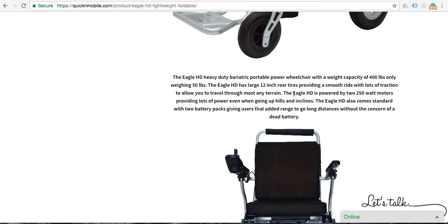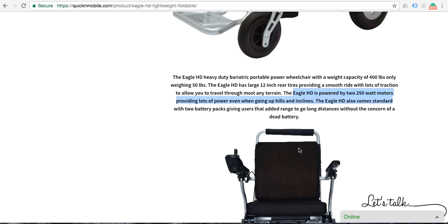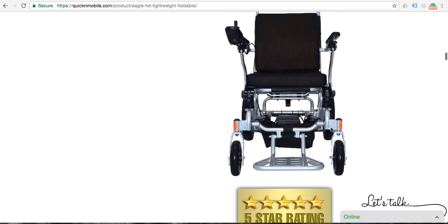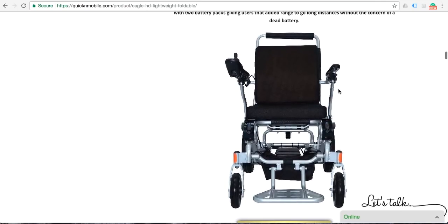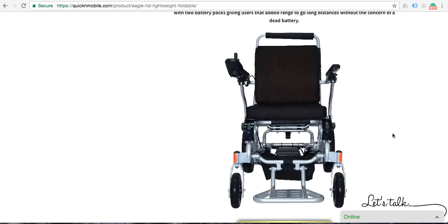The Eagle has 12-inch large rear wheels, providing a very smooth ride with lots of traction, and it also allows you to travel through almost any terrain. The Eagle is powered by two 250-watt motors, providing a lot of power even when going up hills and inclines. From the front, you can see that the Eagle is sufficiently wide with a 19-inch wide seat, which again I will reiterate, there are no other power folding wheelchairs at this point in time that have a seat that is 19 inches wide.